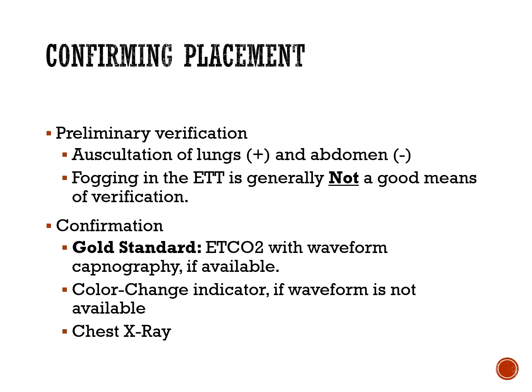Confirmation: the gold standard, again, is end tidal CO2 with waveform. It is capnography. So waveform capnography is a bit of a redundancy because that's what capnography means. Color change: if you have a colorimetric color change indicator, if waveform is not available, you use the best device that you have, and then eventually a chest x-ray as well. You should also be looking at other things like your saturation, looking at the patient's color. Saturation, even with a successful intubation, may continue to drop slightly because it's a lagging indicator. It's going to take 30 seconds or a minute or sometimes longer to come back up.